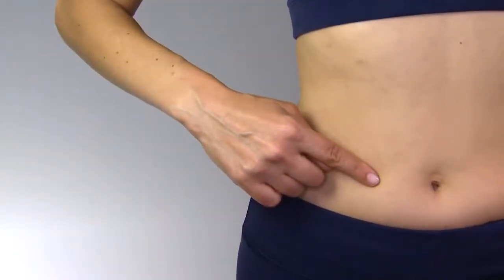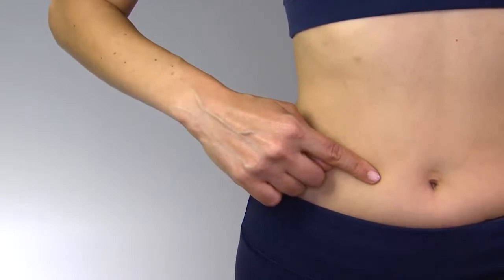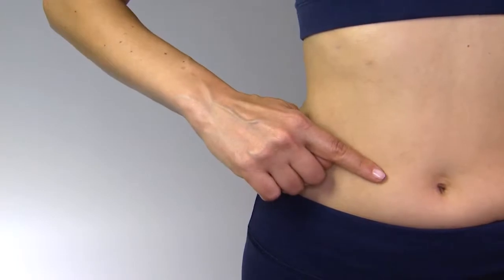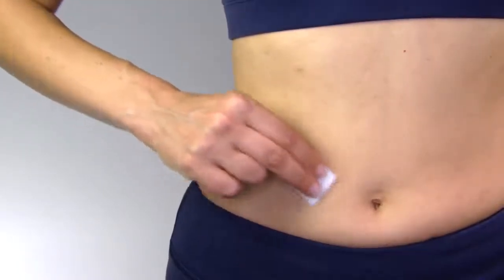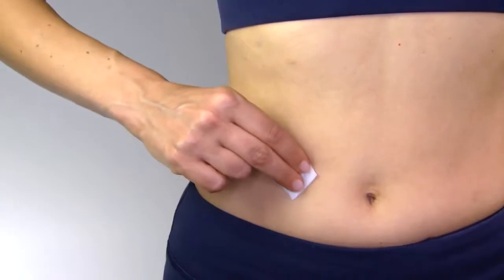Step 3. Injecting your dose. Your doctor, nurse, or pharmacist should provide you with injection training. Inject the prescribed dose as directed. Usual injection sites include the skin on the stomach, upper arm, or upper leg. Change the injection location each day to minimize discomfort. Choose your area and clean the recommended injection site with an alcohol swab and allow it to air dry.